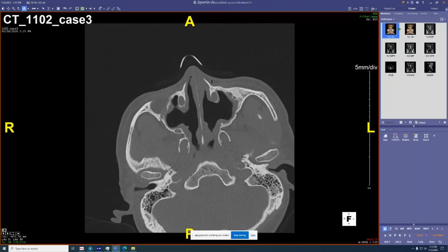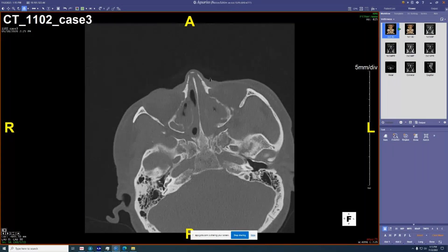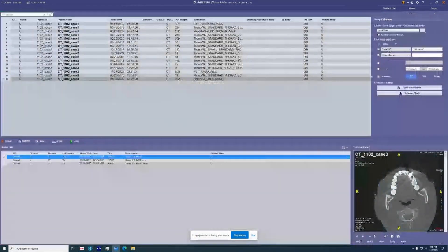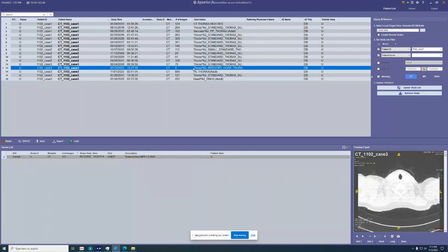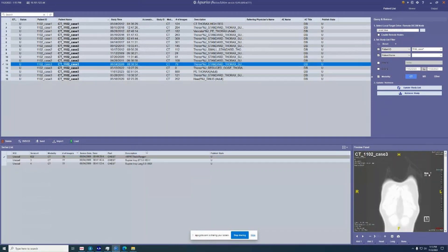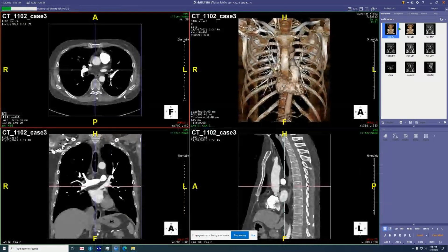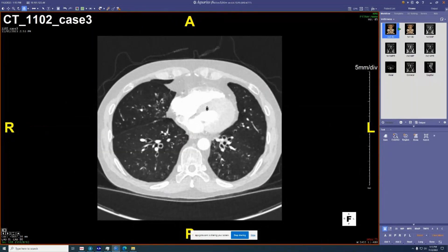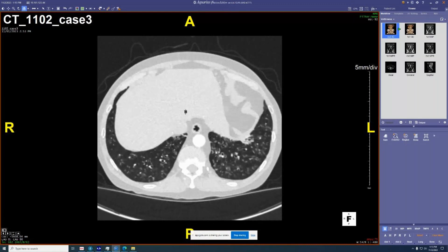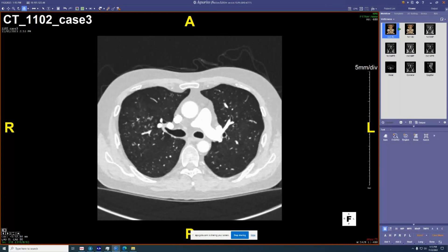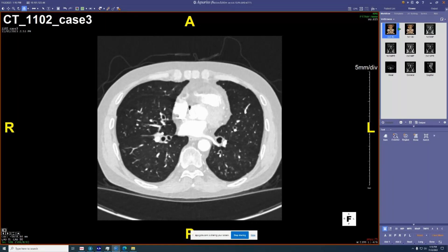We usually see destroyed sinuses and post-surgical changes in CF patients. Here's a study done on this woman — the sinus CT was from a year or two ago. She has bronchiectasis, but it's not in the right distribution for CF — it's lower lobe predominant and involves all five lobes. The tree-in-bud nodularity and mucus plugging are worse in the lower lobes, so you start thinking about ciliary dyskinesia, but she doesn't have that.